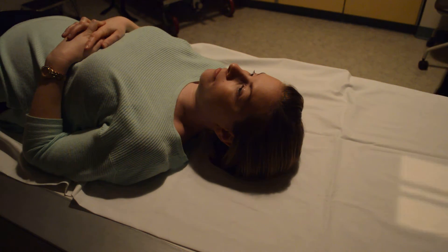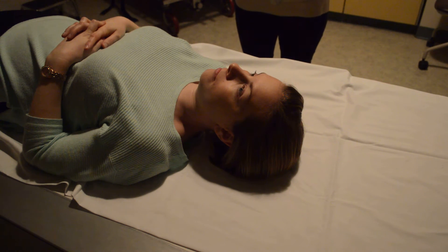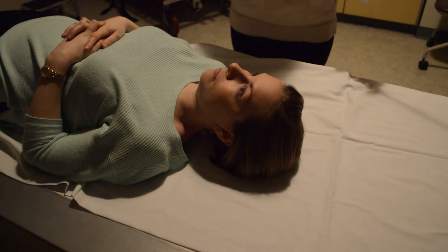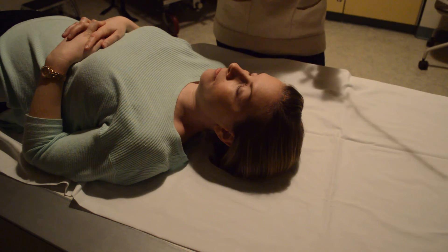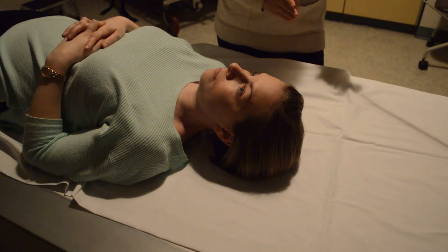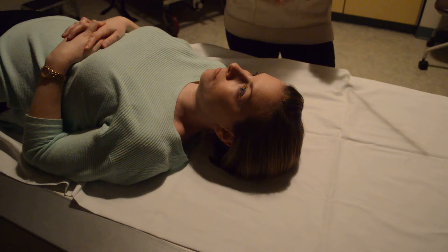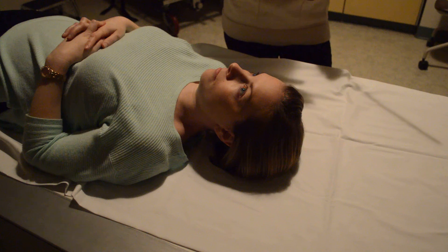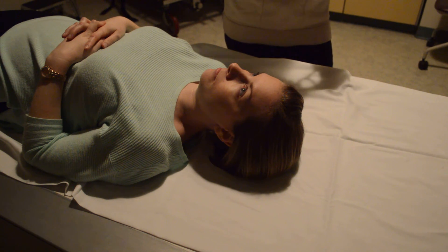Now we're going to do all of the trauma positions for the skull, starting with the trauma Towne's. In this situation, envision that Libby's wearing a c-collar, so I'm not able to manipulate her head at all. I can't have her flex or extend to make her OML perpendicular to the IR. So I have to find out what her OML is and then add 30 degrees to give us our Towne's projection in a trauma view.